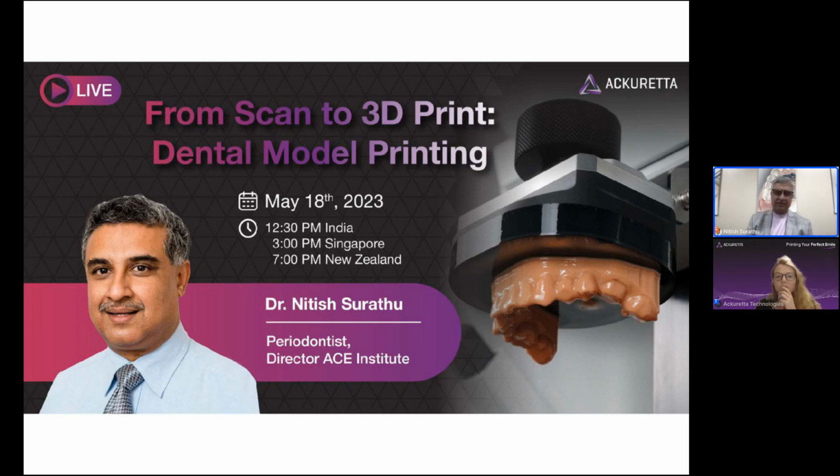I don't personally print too many solid models, to be honest. I print a lot of hollow models. I can't remember the last time I printed a solid model in my own lab. That has very little application for me. But yes, if you wanted to close a model, it's very easy to do with mesh management software like Mesh Lab or Mesh Mixer. Any of those will do that for you.